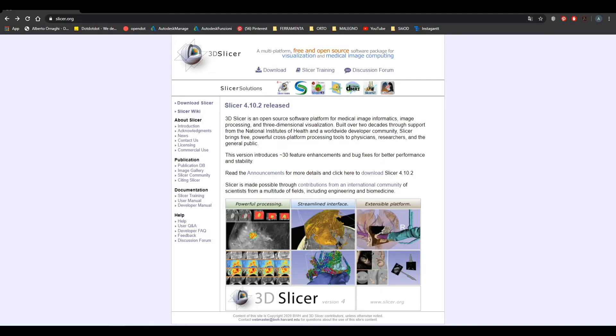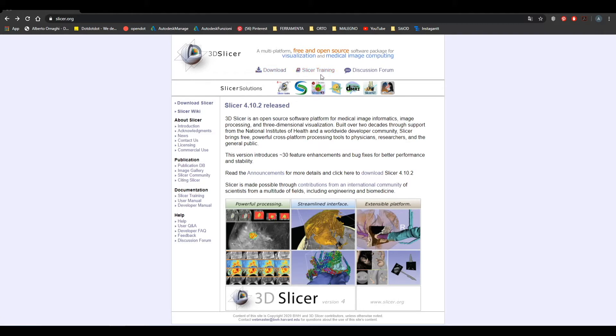3D Slicer is an open source software that allows you to view or process medical images such as MRI or CT scans. On the website slicer.org, in addition to downloading the software, we can find a lot of documentation and a forum made up of a very active community.